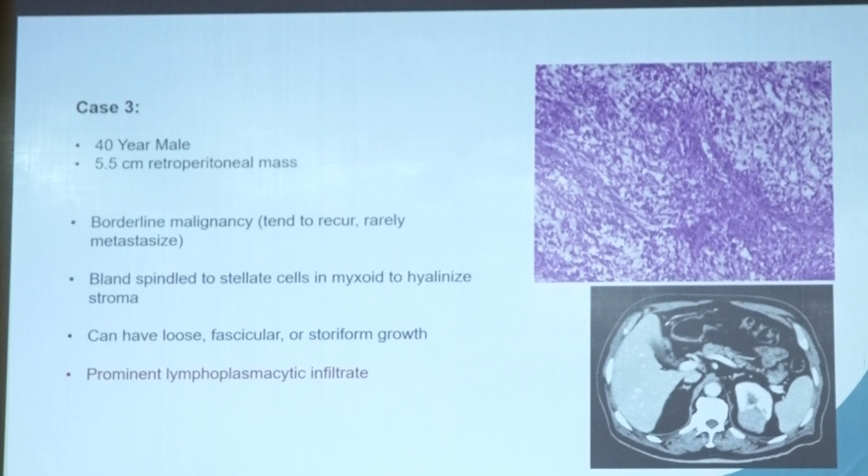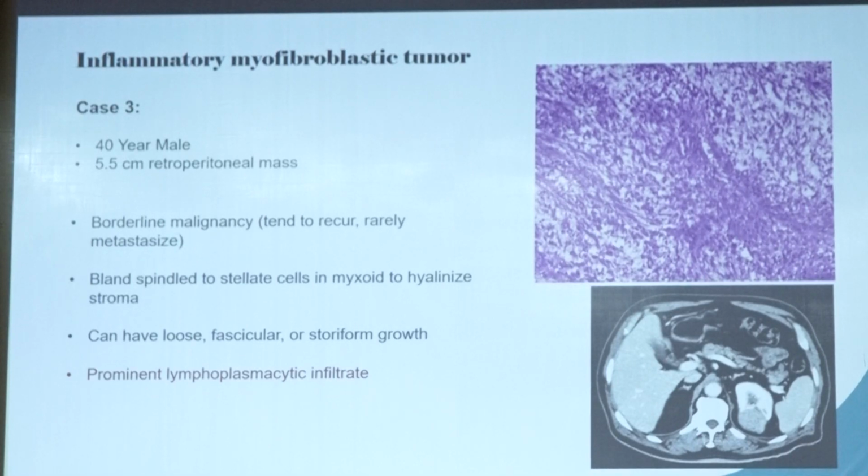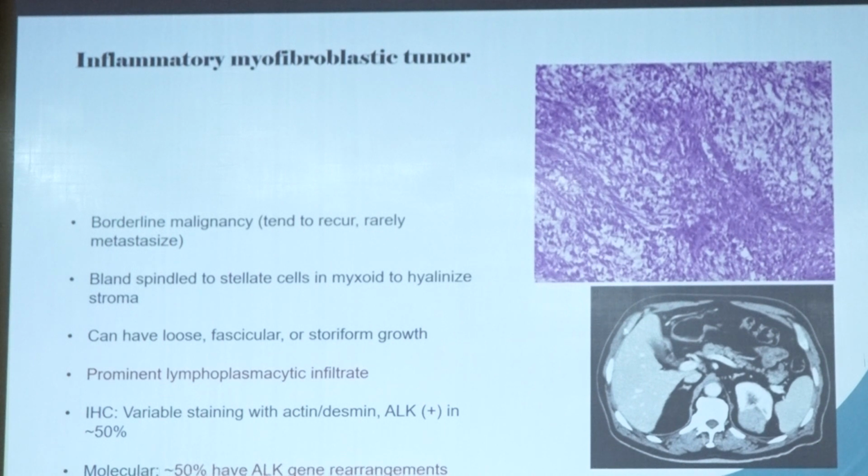So then we are dealing with, yes, we are dealing with inflammatory myofibroblastic tumor, and this also has ALK positivity. And again, ALK came, good. If ALK did not come, it doesn't mean that you are not dealing with inflammatory myofibroblastic tumor or inflammatory pseudotumor, because it comes in 50 to 60% of the IMTs only. So ALK is not to be totally depended upon.